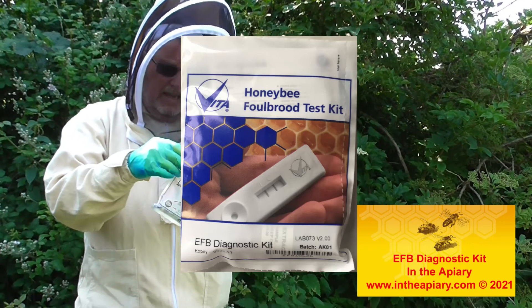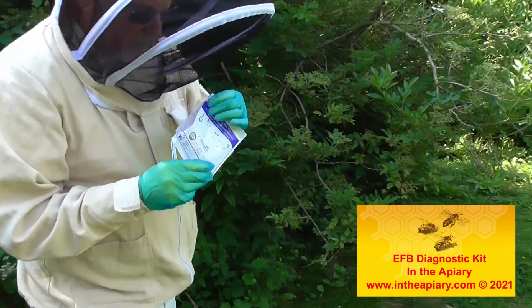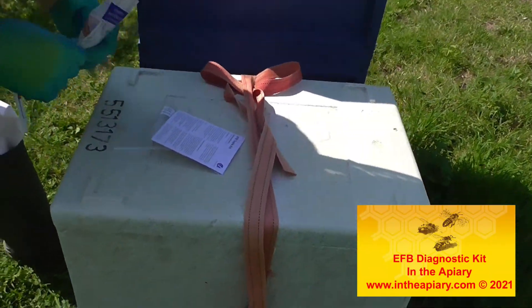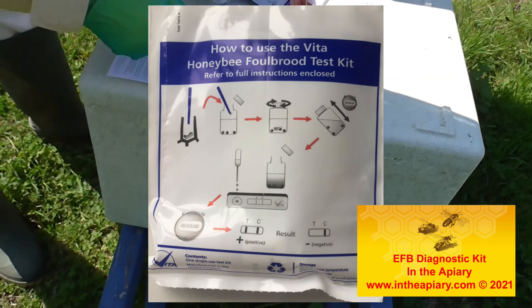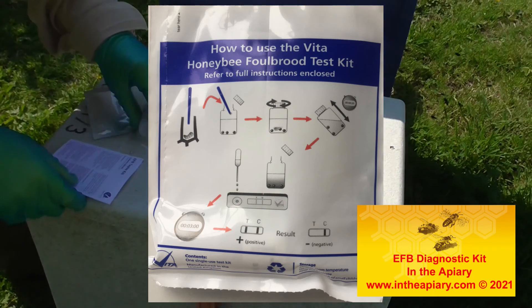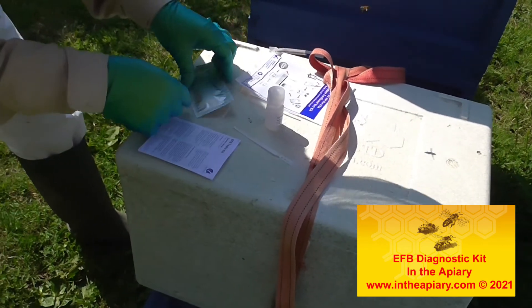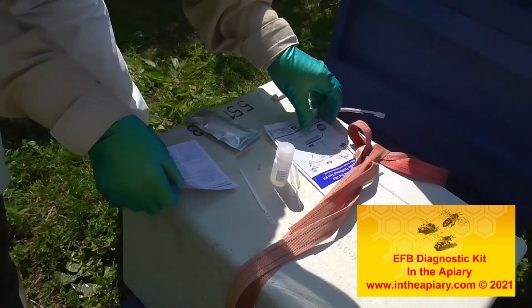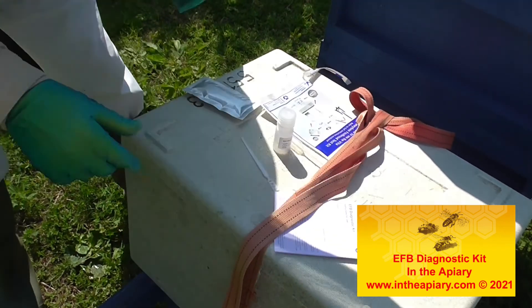Basically you've got to get in there and do a dipping test in one of the larva cells. So let's undo it and see what parts are actually in here. It looks very similar to the kits that we have used for our Covid testing. All bits ready.